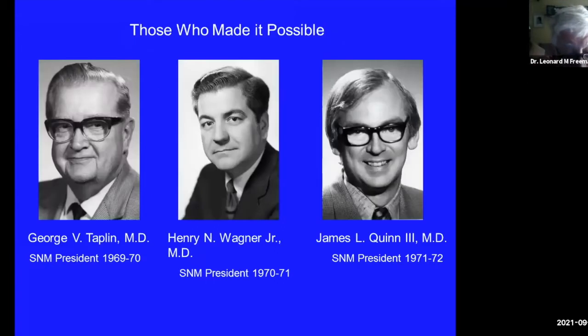Okay, I always like to show the picture of these three gentlemen. Dr. George Taplin, who was at UCLA. Dr. Taplin's the gentleman who actually derived the concept of using macroaggregated albumin for performing lung scans. And Drs. Henry Wagner at Johns Hopkins and Jim Quinn at Bowman Gray at the time, and Wake Forest, were the two who first actually used it in humans.